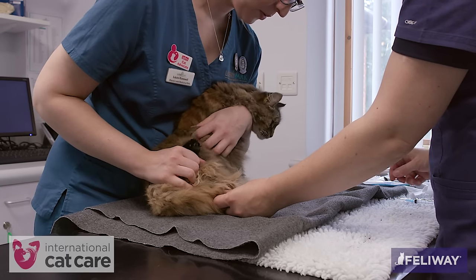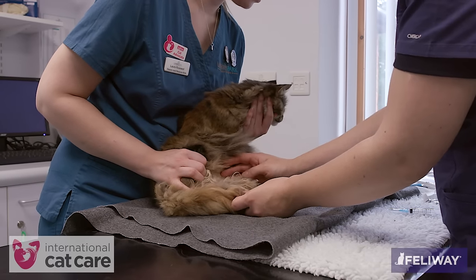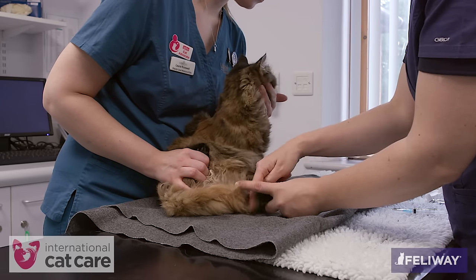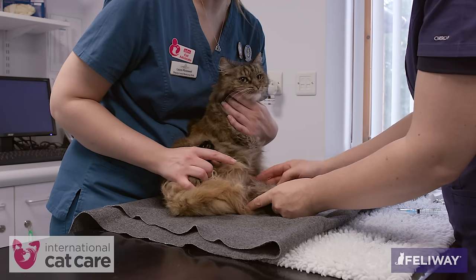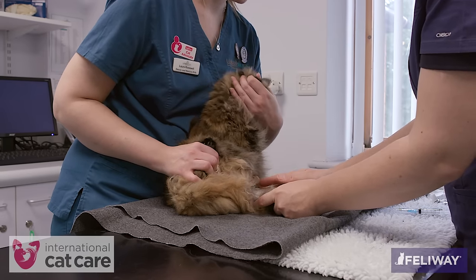This relaxed cat is restrained by one person while another takes a sample. However, two people may be required with less cooperative cats. One person to gently restrain the head and forelimbs, and another person to hold the hind limbs. As before, the cat is held on a large soft towel.